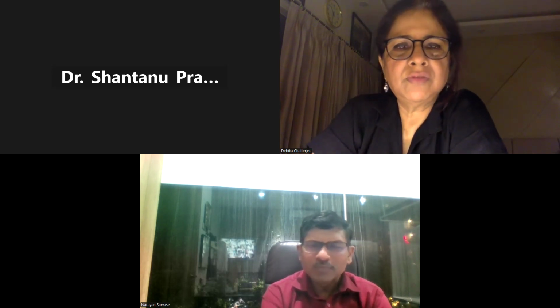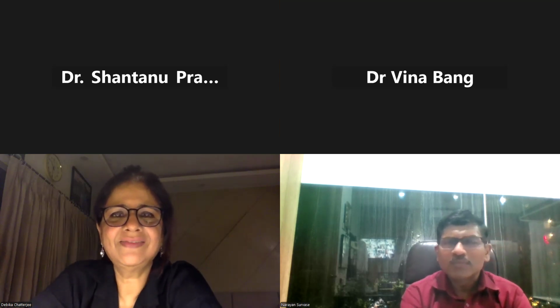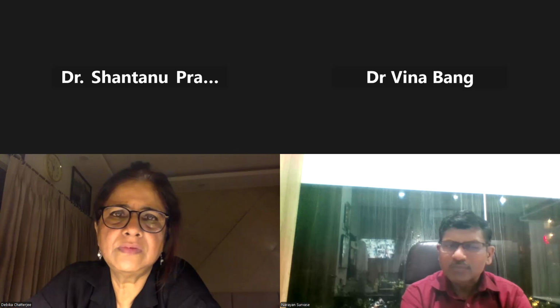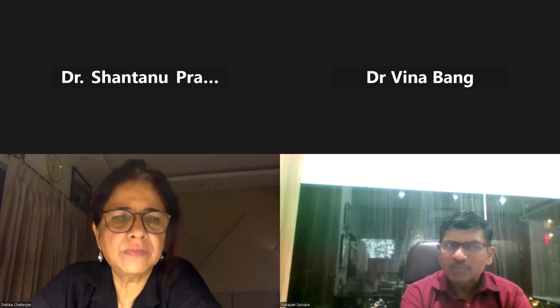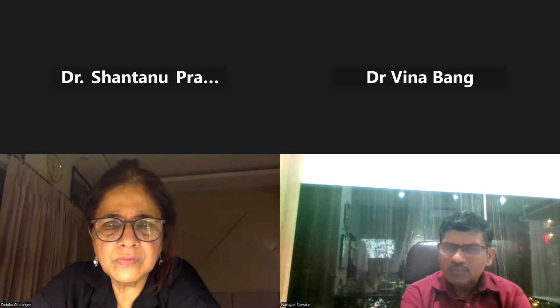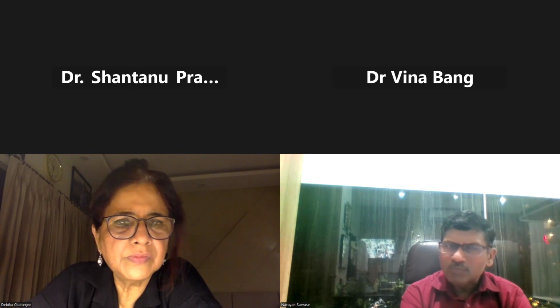Good evening, ma'am. Thanks for the wonderful and elaborate talk on diastolic dysfunction. My question was just to simplify the talk, ma'am. When we are by the machine and leaving aside other parameters because they are straightforward, when it comes to putting the pulse wave Doppler across the mitral valve, when we have the graph of the E wave and the A wave in front of us, practically what should be the approach when we look at the E wave and A wave to start with?